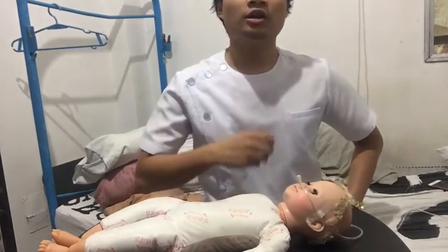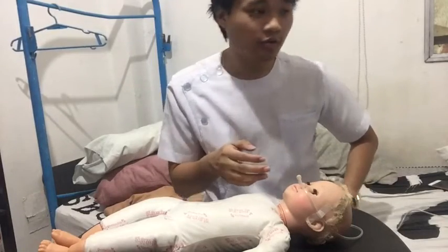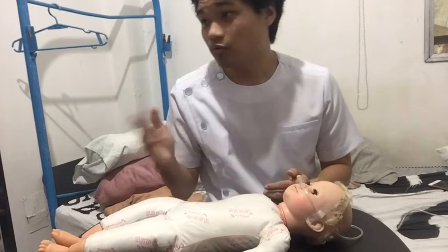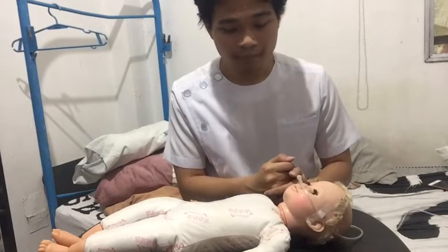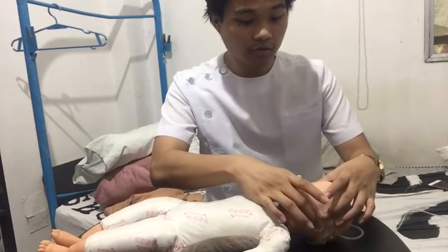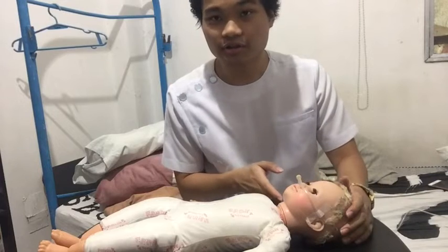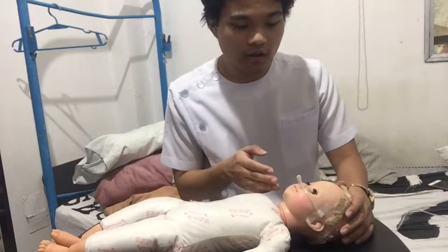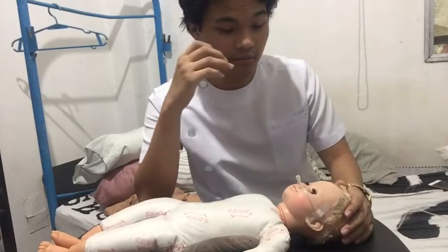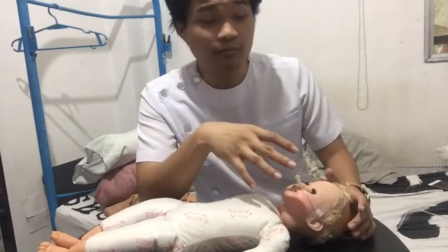And after adjusting the oxygenation, we're going to be explaining safety precautions, especially to those in the room or on watch. And after that, we're going to be checking on the client's external ears, the nose, the mouth, if there's any dryness or skin breakdown, because oxygen actually can make skin dry up faster. So we're going to have to assess if there's any problem.